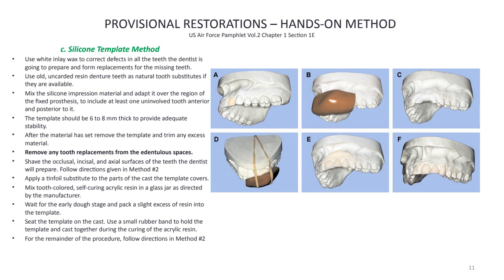the lab putty with acrylic, cure it, remove the provisional restoration from the model, trim it, reshape if it's necessary to be reshaped, polish it, stain and glaze it, and send it to the doctor for insertion.